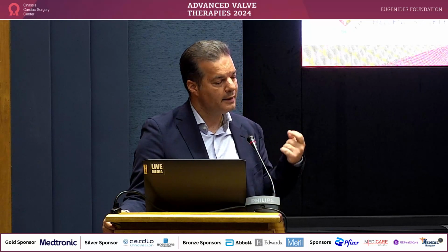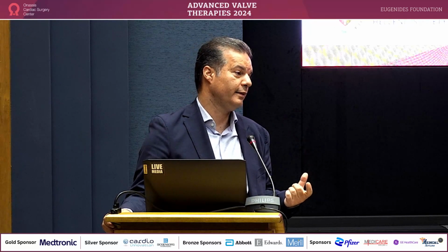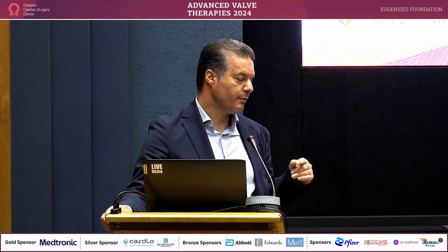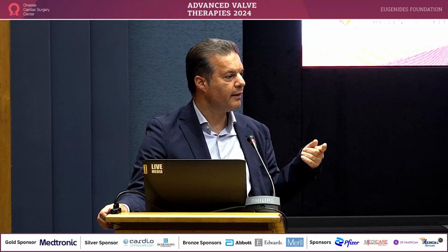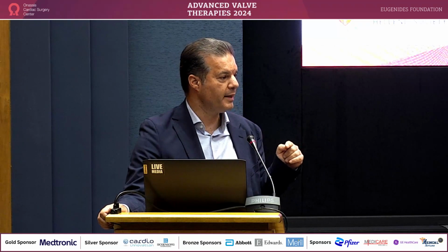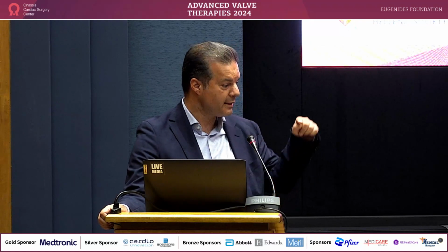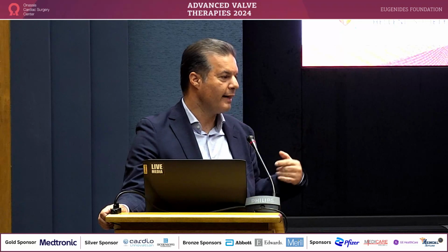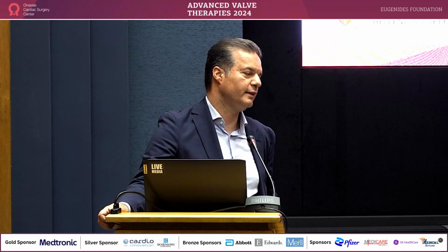Potentially, however, implanting the valve into the anterior leaflet can give you extra anchoring because you've got an additional sealing skirt. And what was interesting, because this case came from our surgeon, the following day he had a surgical endoscopic replacement with MAC, and he said, I'm going to do the same concept endoscopically. So instead of removing the anterior leaflet, he cut it in the middle, he pushed it to the right, and he implanted the valve with stitches, of course, inside the leaflet, and he liked it a lot.